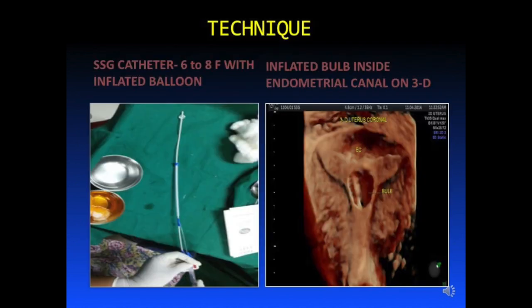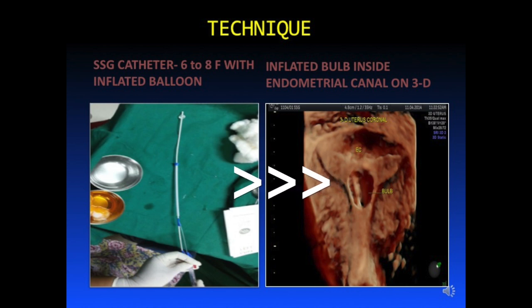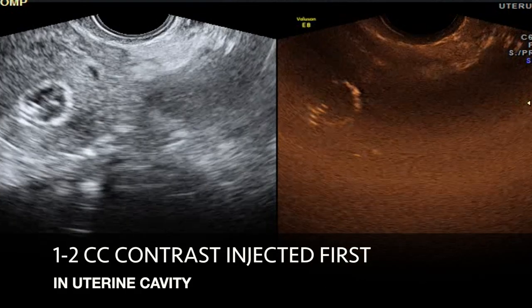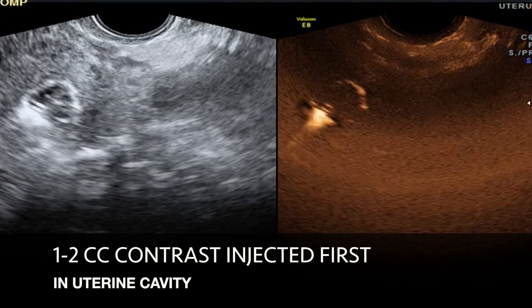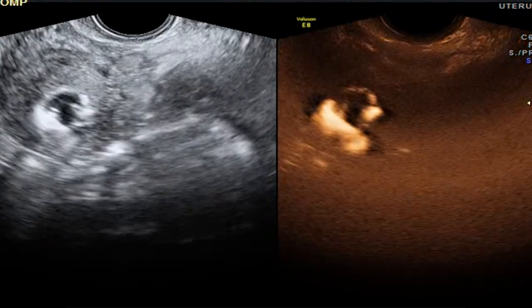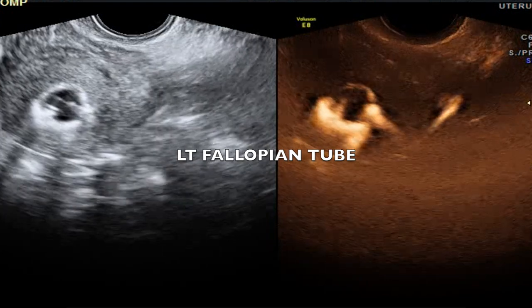We used the 6 to 8 French SSG catheter with an inflated balloon. This was introduced into the uterine cavity using strict aseptic precautions, and this is the image of the inflated balloon in the uterine cavity.